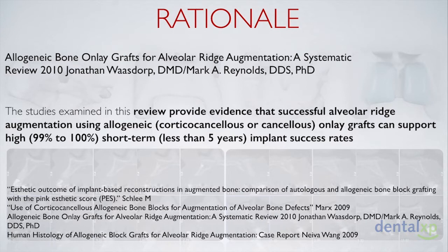The main reservation that usually lies concerning utilizing those allogenic blocks is their lack of vitality. They're basically dead bone. Also, despite their excellent short-term survival rates for implants, the long-term implant survival rates have not been well documented in the literature.